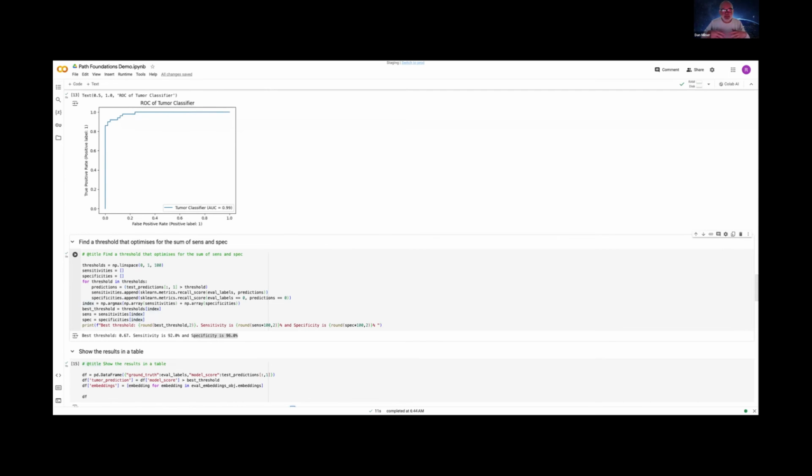But if there was a different approach, so that the whole slide image, prior to the pathologist even looking at it, could be said, okay, this is lung, here are the available algorithms. So that when they sit down, it says, this is a lung case, here are 3 lung algorithms that are available through this platform.